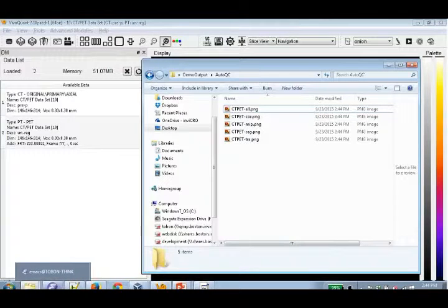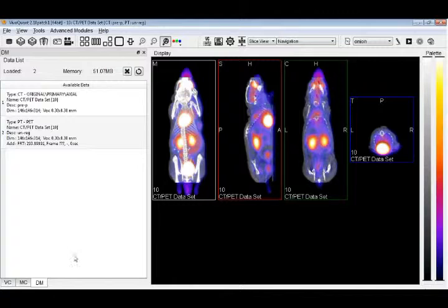Oh, yes. Automatically saving your center slice? In the sense that, VQ, when you load new image data, it automatically centers it for you. But you can either set positions using direct numerical values, or, for example, the 3D ROI tool has a center of mass tool to find the center of mass of your ROI. So one script that's pretty popular that we do is we call that function to get the center of mass, then set that position of the crosshair, then take our QC image, and then do that for every ROI, and then we get a nice little centered picture of every single ROI that I've drawn or automatically segmented.